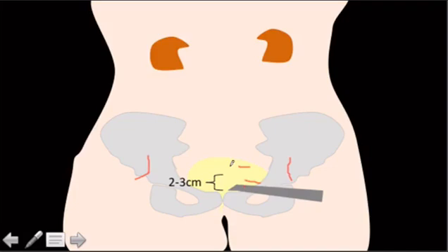Most of the time people will tell you to put a bladder catheter in, a Foley catheter first, but you don't want the bladder to drain. You want it to be distended if possible when you're sticking it. It just makes it easier to stick.